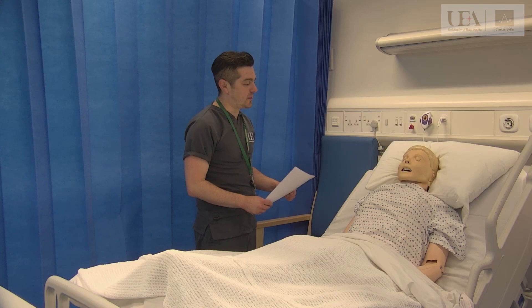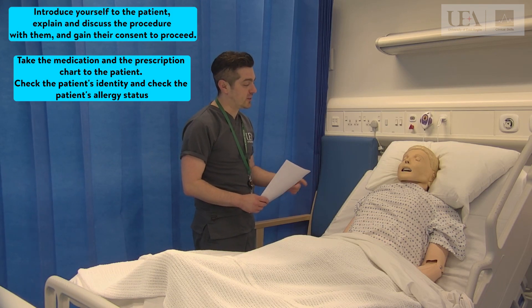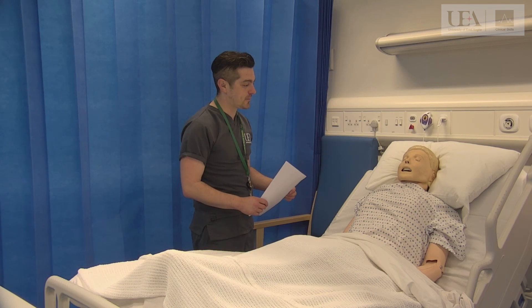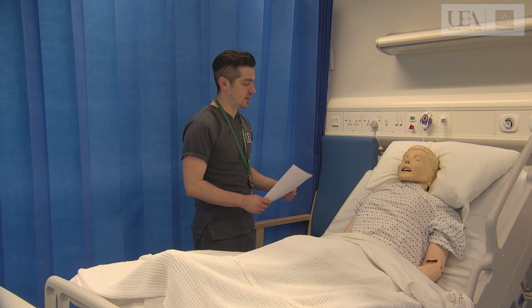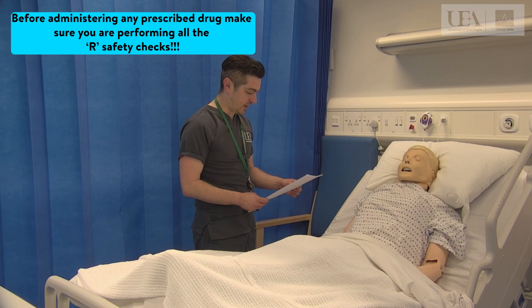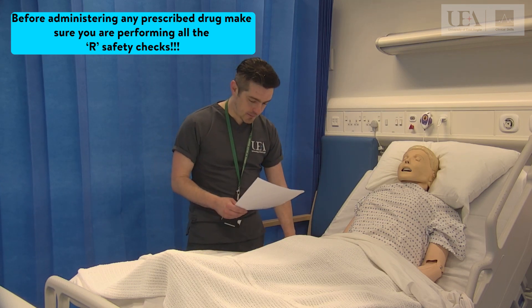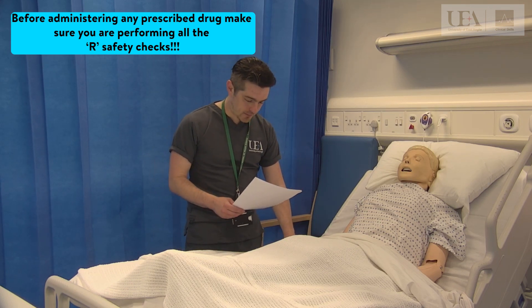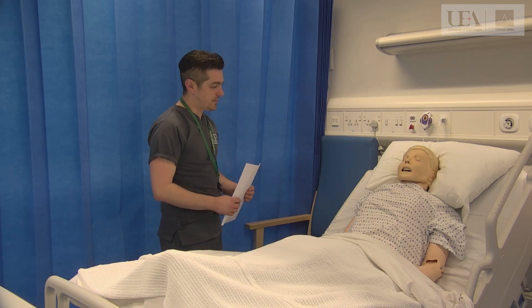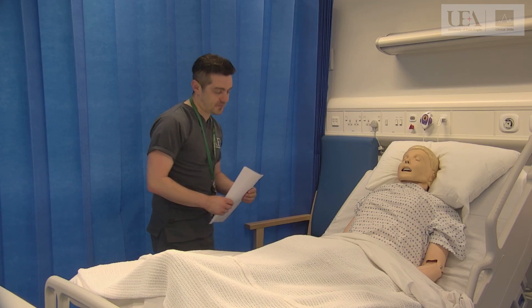Hello, my name's Ben. I'm one of the nurses on shift today. The doctor has just come and asked me to give an injection into the upper part of your arm — would that be okay? Fantastic. Just confirm your date of birth and name for me. I'm just going to check your wristband. Yep, that all matches up. Have you got any allergies? Okay, I'm going to go and prepare your injection. I'll be back in a while.